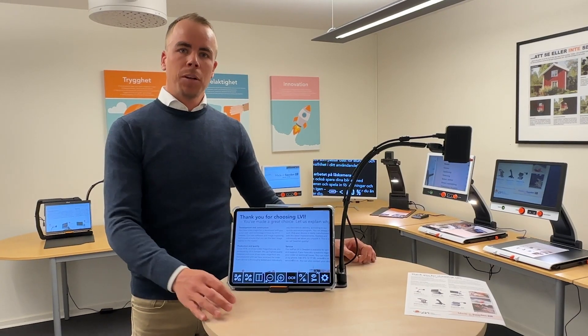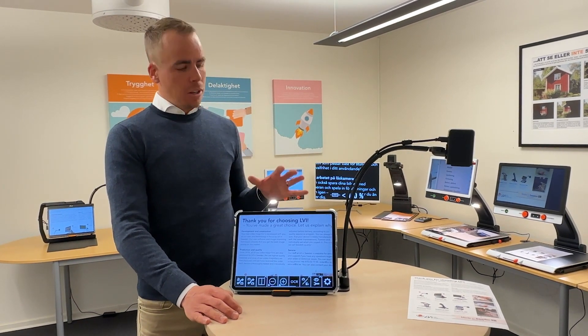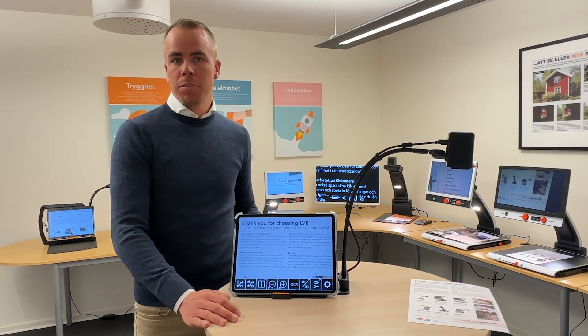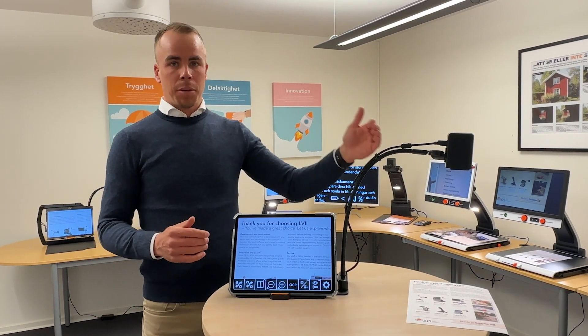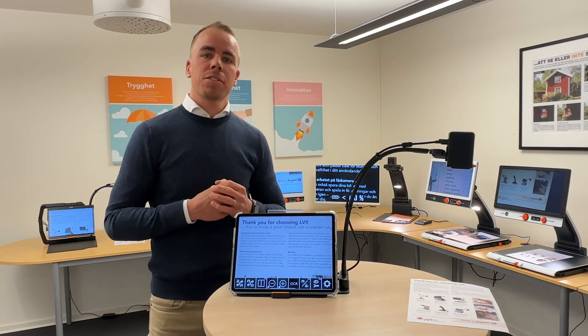Today in this video we're going to take a look at a new product that we are going to release this summer: MagnaLink Wi-Fi Cam. That's the name of our new solution for iPad users. It's a solution with its own battery, running the device for up to 6 hours. The stand is designed so you can have the external camera on the right side or you can turn it and have the camera on your left side.